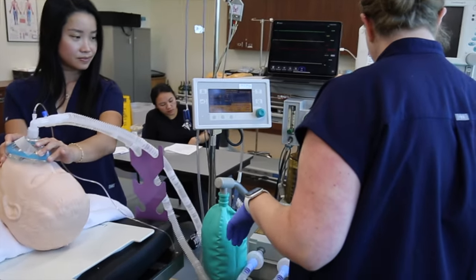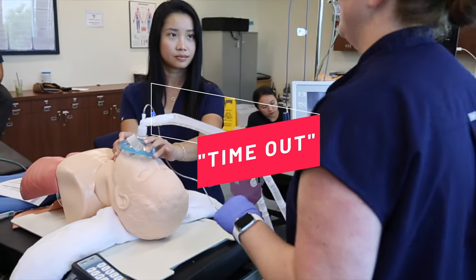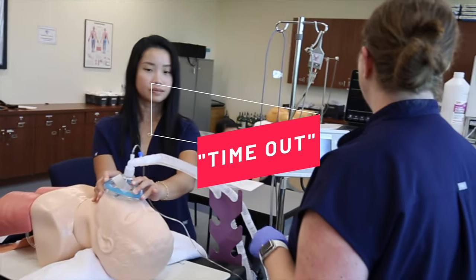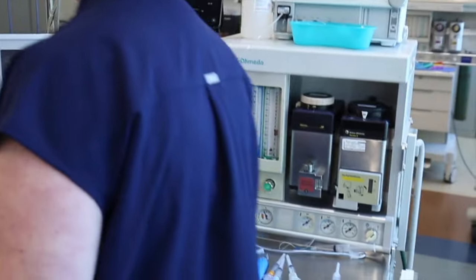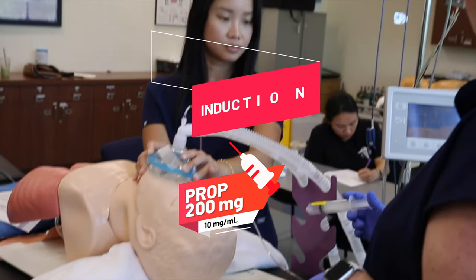So at this point, we're going to do an anesthesia timeout. I see my end tidal O2 is greater than 80. I have all of my vitals connected and they look okay. And I have high flow, 100% FiO2. So now I know it's safe to push my propofol. So I'm pushing my propofol.